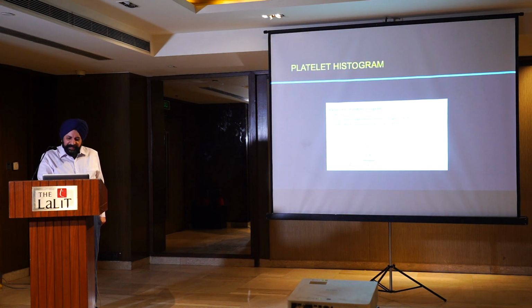Next, the area to the right of the 12 femtoliter discriminator is the area of the platelet large cell ratio, and this broad base is the platelet distribution width.